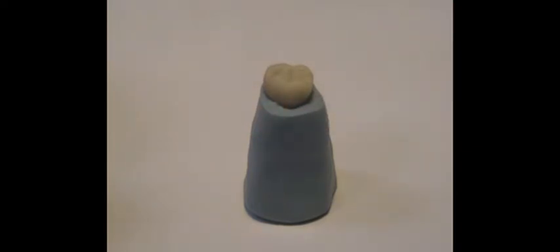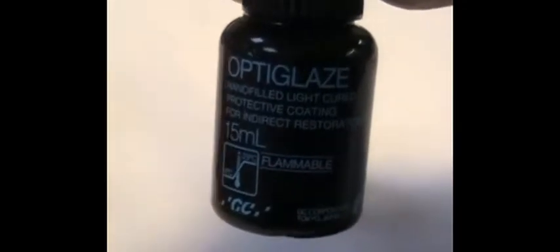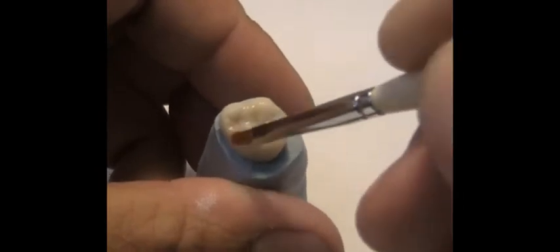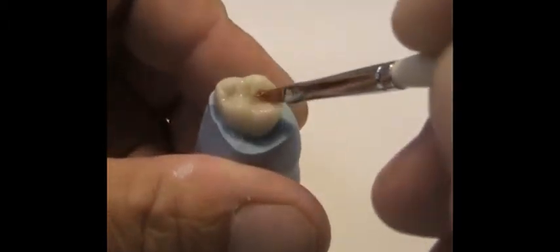I take a little bit of the OptiGlaze clear and I'm going to coat the unit with a light coat of the clear. What that does is give me a bond to the unit.